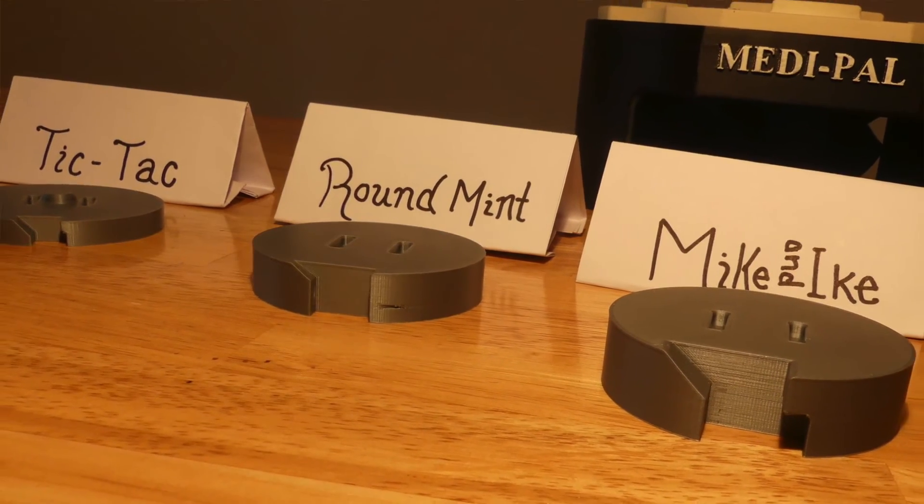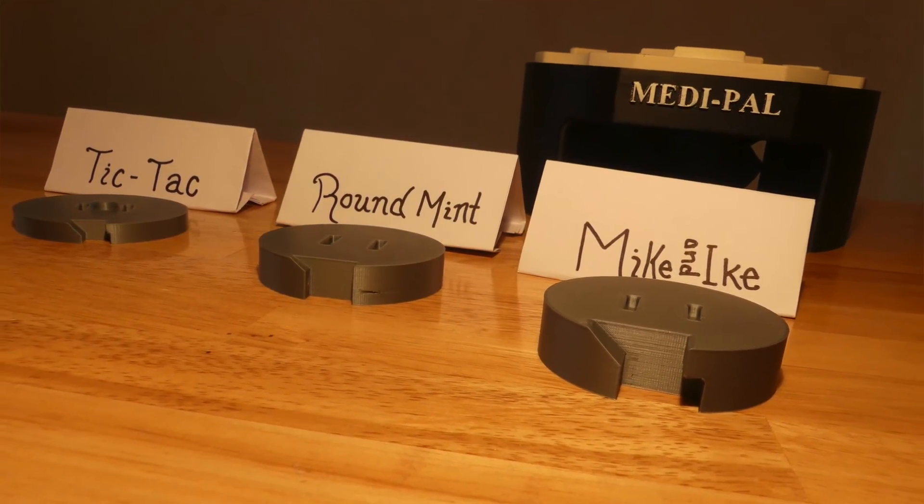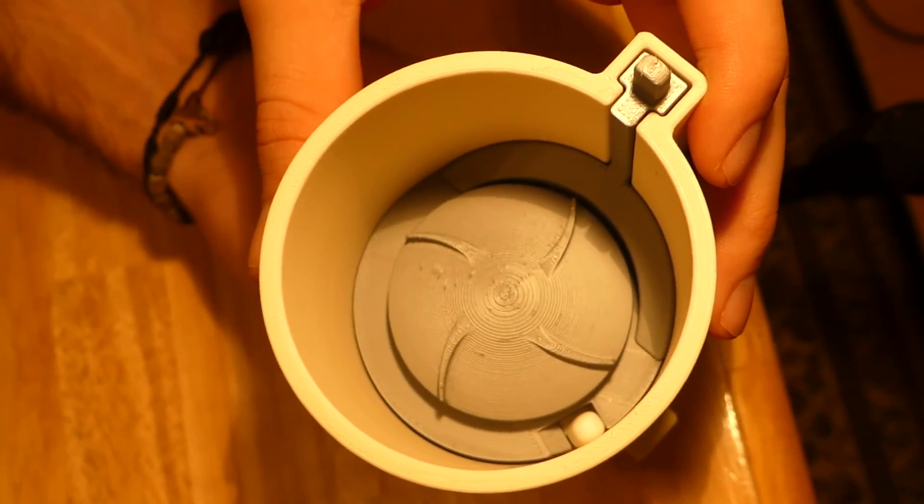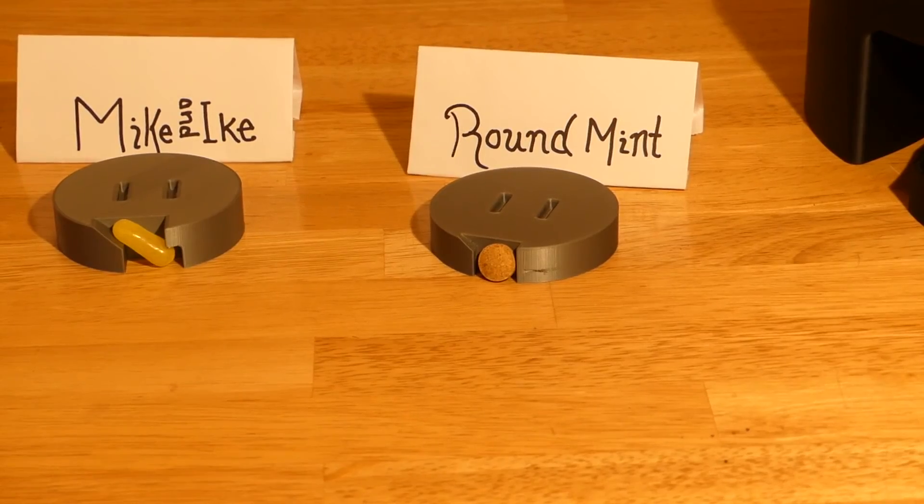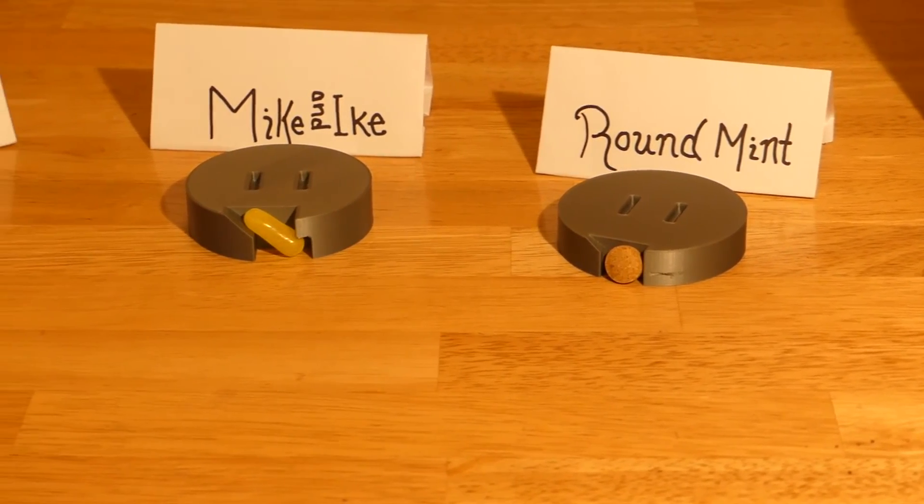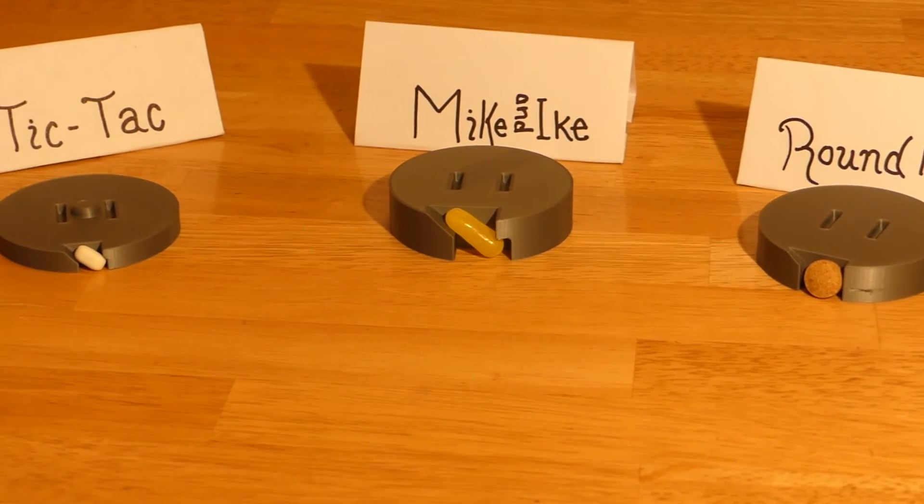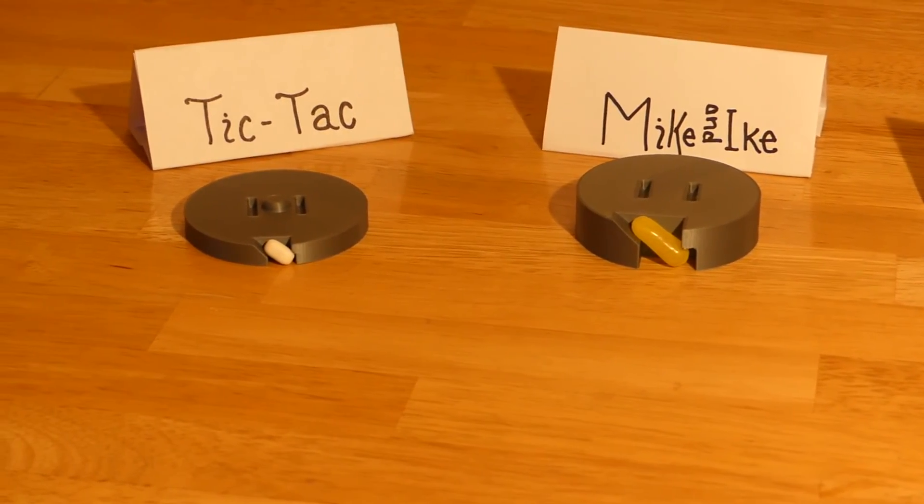The rotating discs are all of different thicknesses depending on the length or height of the pill they are designed to dispense. This prevents the pills from getting caught by the sweeper arm as they are being rotated. Each rotating disc also has a unique slot in them to fit the shape and size of the pill they dispense.